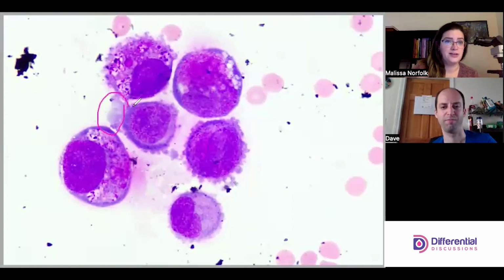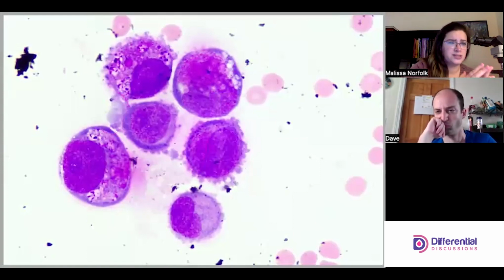These are big ugly cells. So it's kind of like these big ugly blebs, these polychromatophilic, for lack of a better word. It's just they're multiple colors. They're interesting. They're not even blebs like you would expect to find in lining cells. So they're large. You could look at them and think, well, is it just a lining cell? No, because of the blebs and because of everything else that we've talked about.